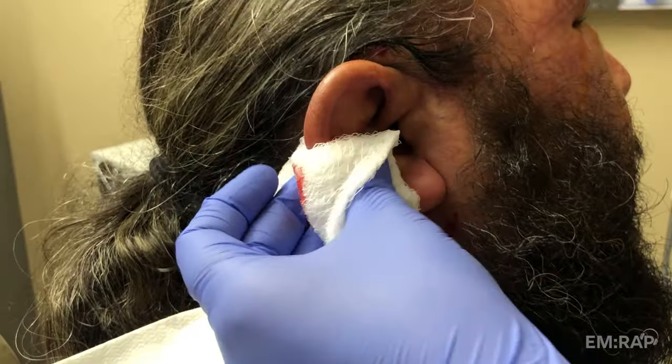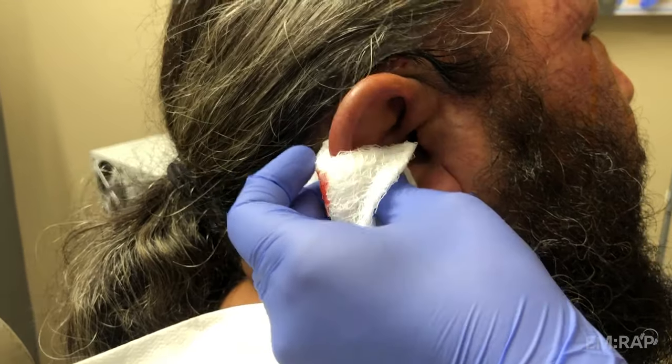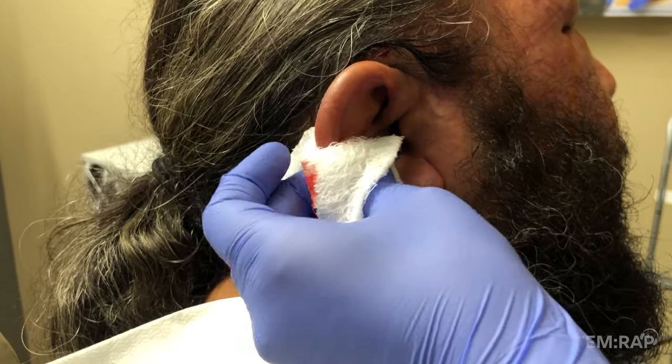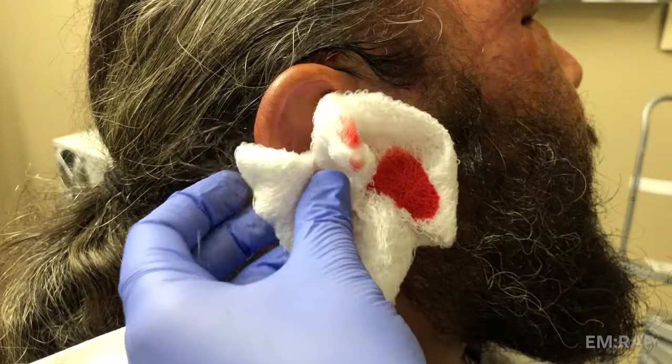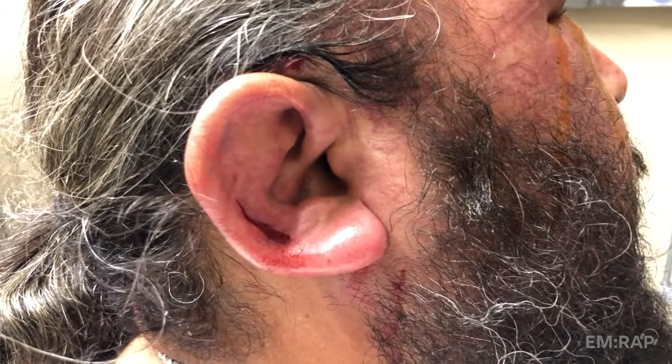Now really get in here and use some pressure to squeeze out all that blood so it flattens back down to normal. You can see it's a dramatic difference once the blood is out, and it's still dripping a lot — that's why it's going to need a compression dressing at the end.